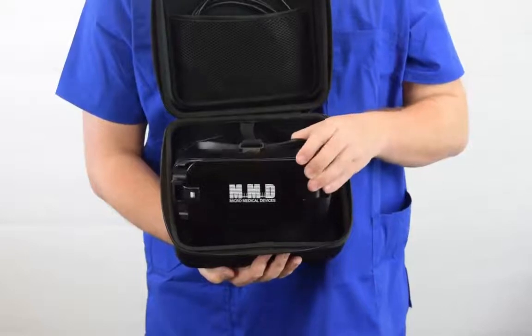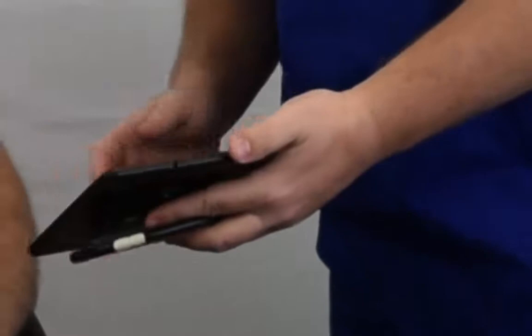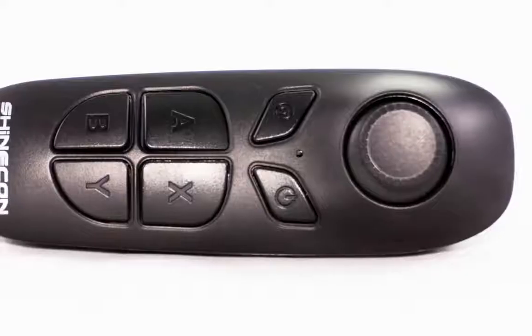When you're ready to use the device with a patient, remove it from its carrying case, show the patient how to put it on, explain how the device works, and how to respond to the lights that will appear during testing using the handheld controller.